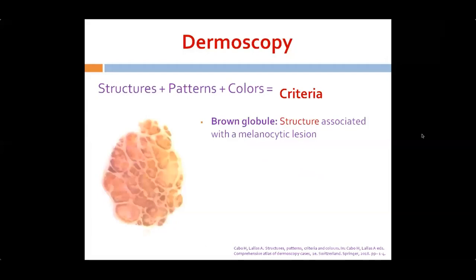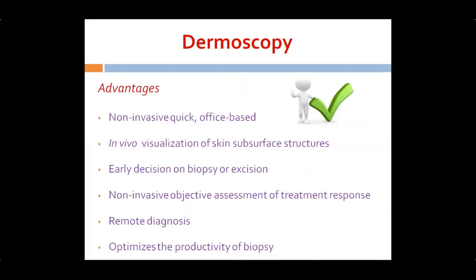And it provides a non-invasive objective assessment of the treatment response. The images can be shared, which allows remote diagnosis of conditions as well. And as I said, dermoscopy-directed biopsy improves the productivity of biopsy.